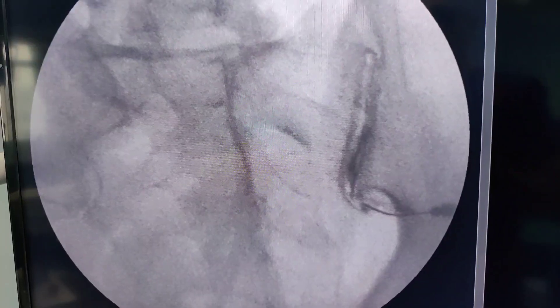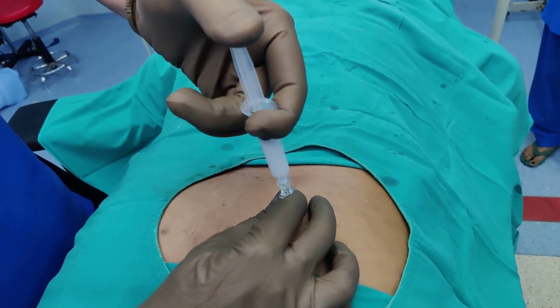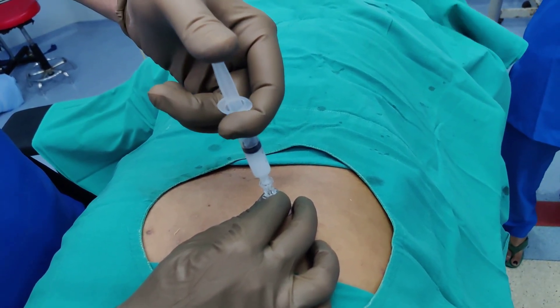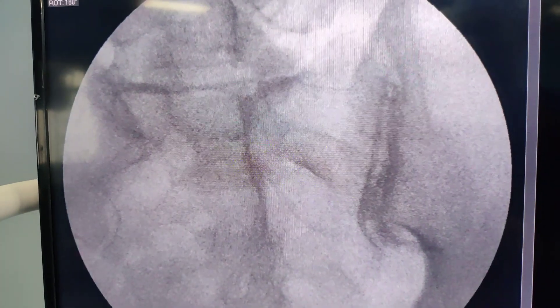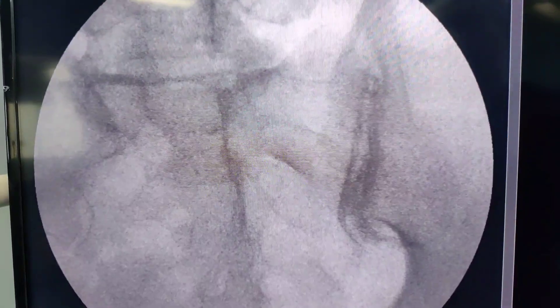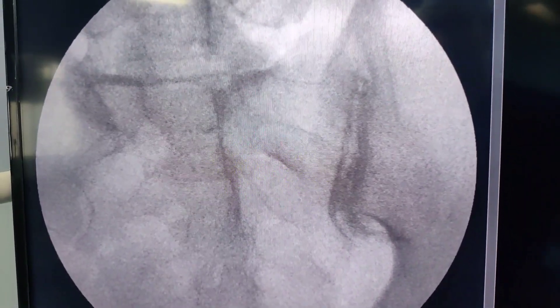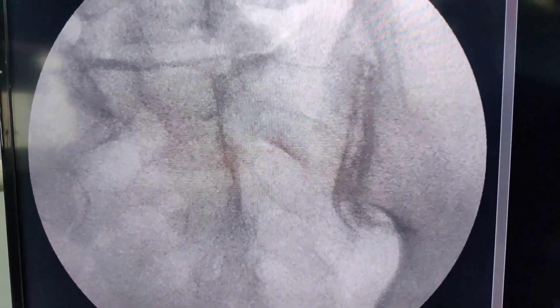The next step is to inject the mixture of steroid and lignocaine. The patient may feel some sense of pressure, so just be slow and keep injecting. We had some difficulty and managed to inject around 3 ml, after which the needle moved and had to be repositioned. Once you give the local anesthetic and steroid, the dye should wash off, which confirms you have injected in the right spot.